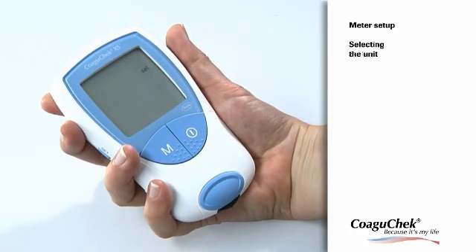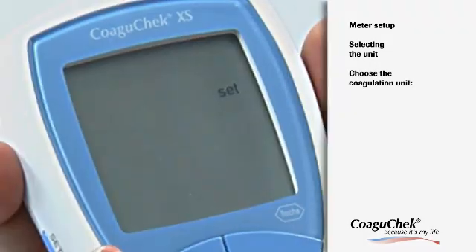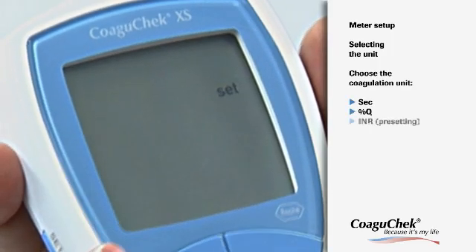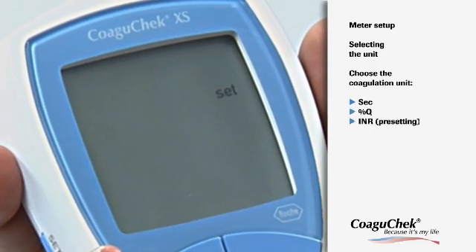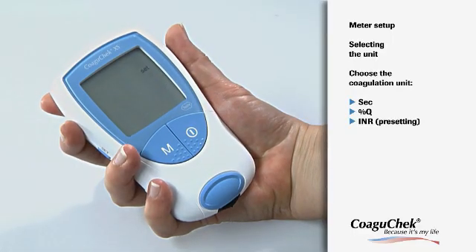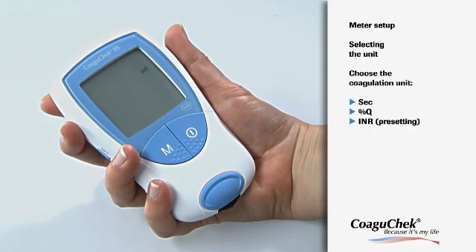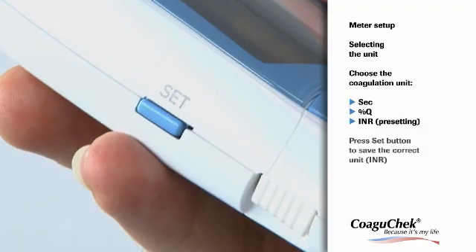It is important that you select the right coagulation unit. The CoaguCheck XS meter offers you three options: seconds, the Quick value, and the INR value. Please ask your doctor if you are not sure what to select. Press the M button to move through the three options and confirm your setting using the Set button.